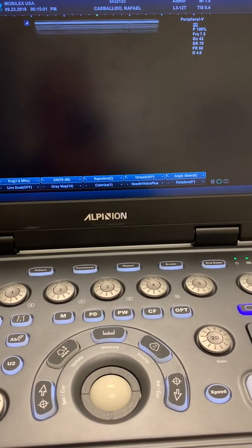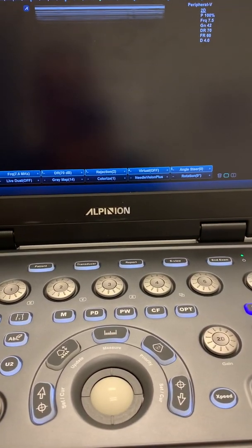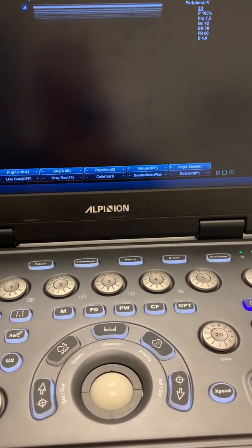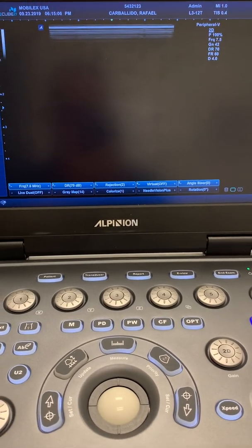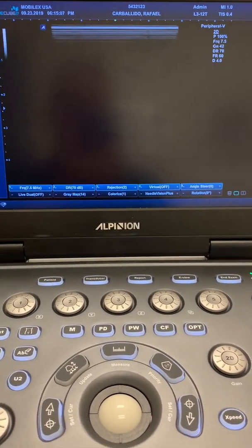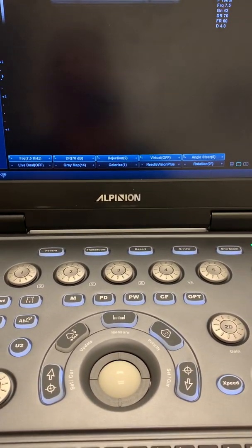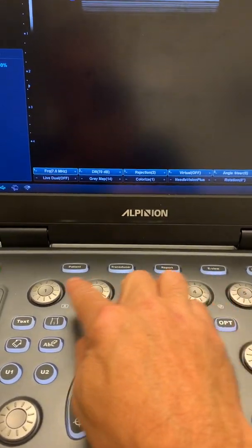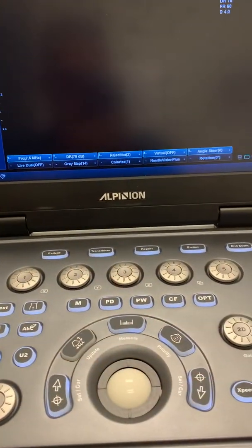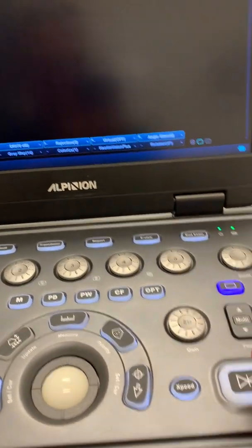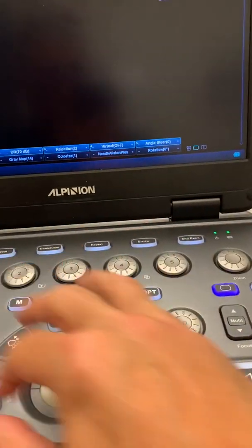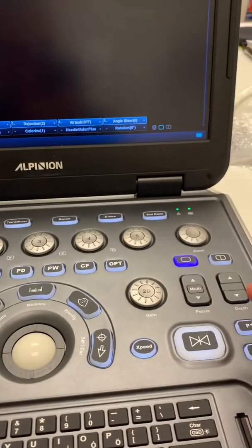In this video we're going to show you how to use the harmonic imaging in the Alpinion EQPi 7. You will not find a dedicated harmonic key anywhere on the user interface.